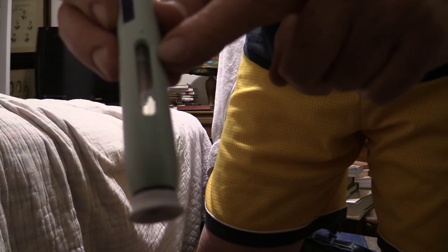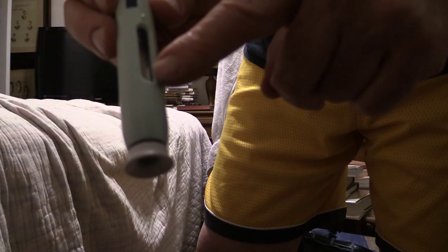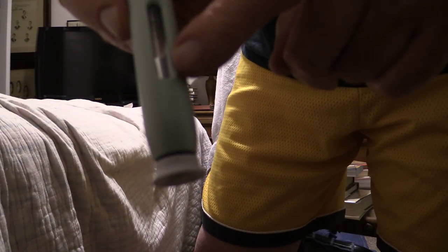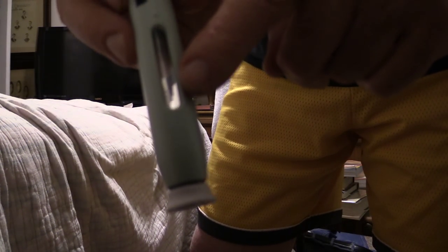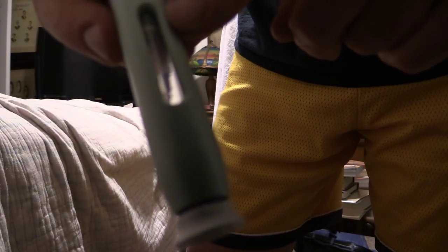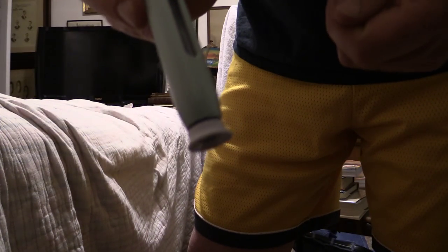You'll get an indication too — if all the chemical has been injected successfully, you'll get a colored bar. I've never had that problem. They say 10 or 15 seconds; I always count to 20. I give it as much time as I can and I've never had a problem — all the fluid is injected and it works perfectly. I can't tell you enough times: read the directions and do it how they say, but this is how I've done it and I've had perfect success. It's a no-brainer — anybody could do this.